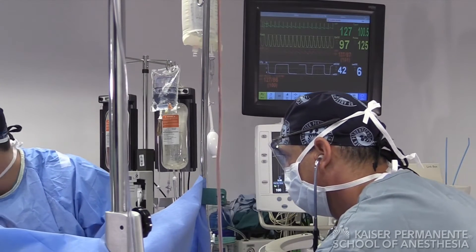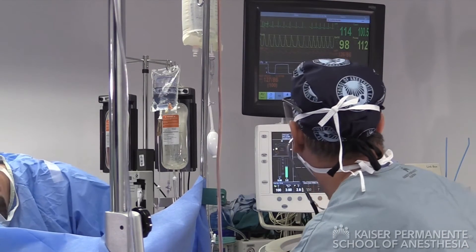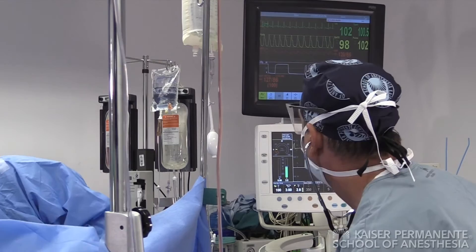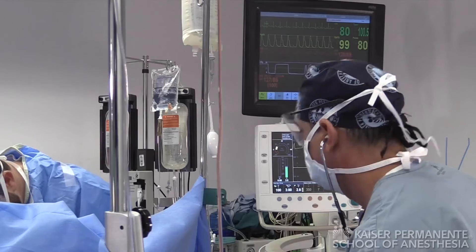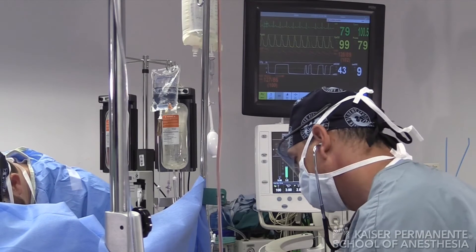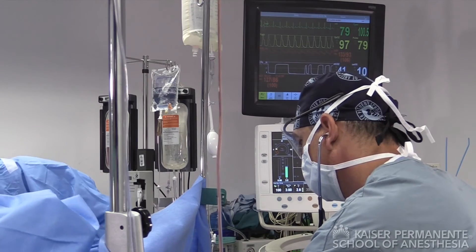Where are those last packs? The suction right there. Use that. Looks like that's a little more controlled. Do you see any bleeding right there? No, it looks good.